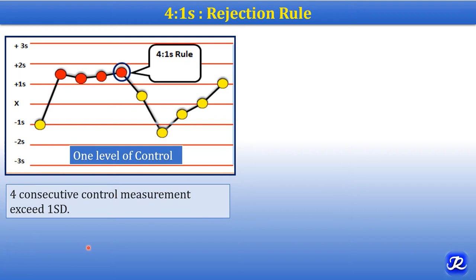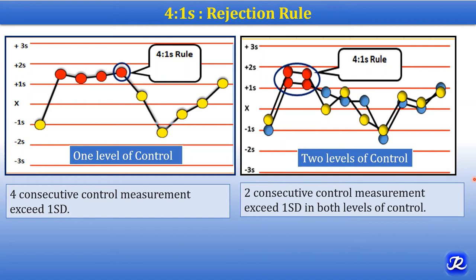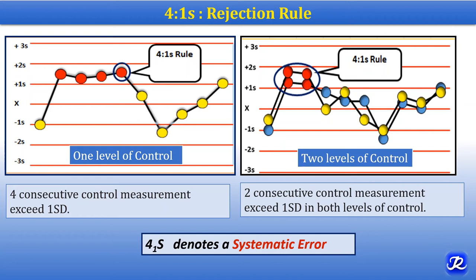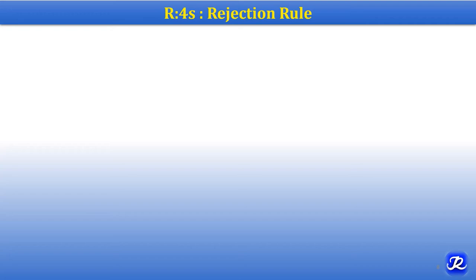The 4-1S rule is applicable for both one-level and two-level controls. When only one level of control is used, four consecutive control measurements exceeding one standard deviation on one side of the mean violates the 4-1S rule — for example, the second, third, fourth, and fifth control measurements all exceeding one standard deviation. When two levels of control are used, two consecutive measurements exceeding one standard deviation in both levels of control — two values in level 1 and two values in level 2 — constitutes a 4-1S rule violation, which is a rejection rule denoting systematic error.